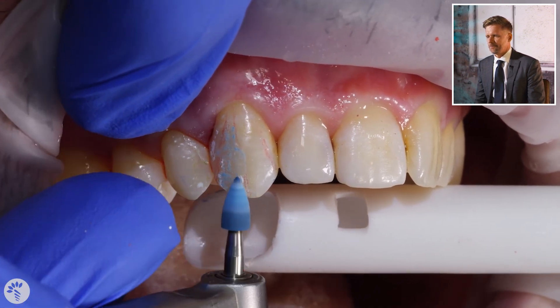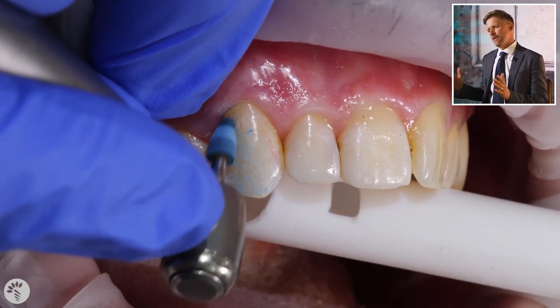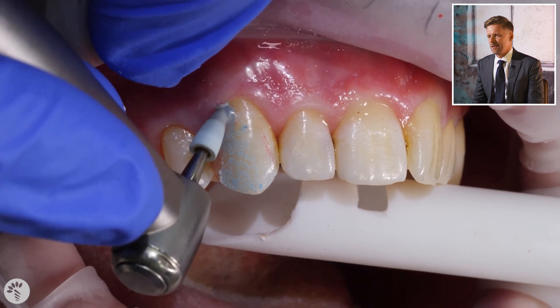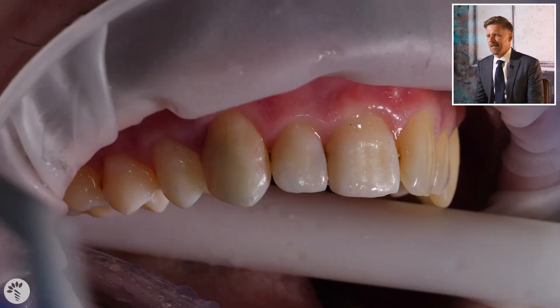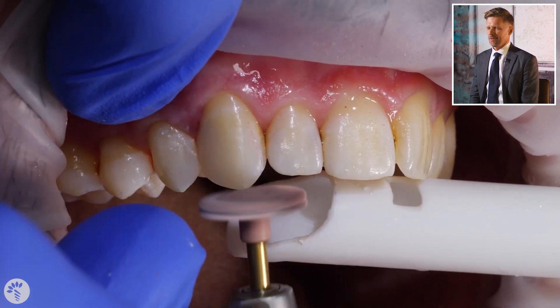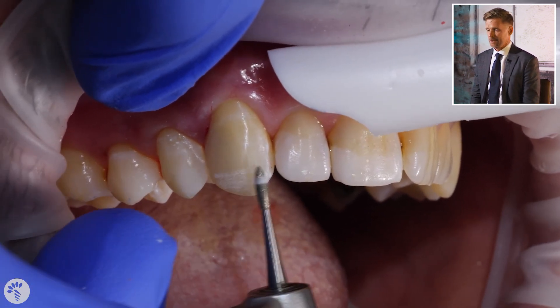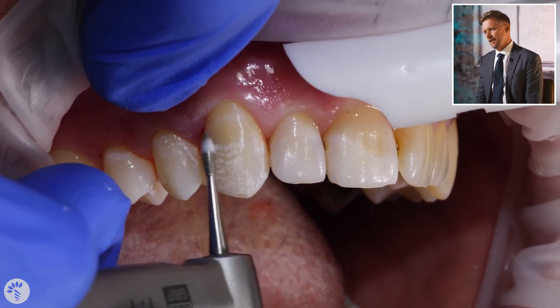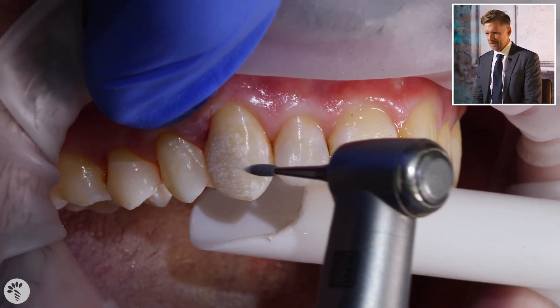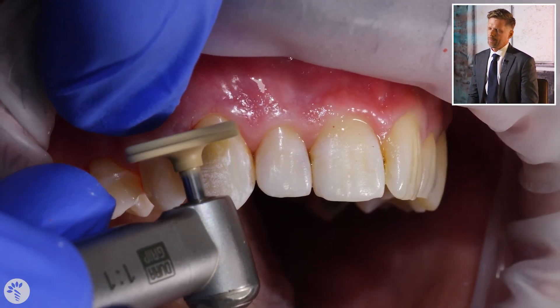If we want more pronounced texture, we'll do that later with a slow-speed bur. We want chunky, square corners at this stage because as we polish, the restoration gets rounder. With ceramics it's completely different — because they're so hard you need to have them rounded before glazing. Now I'm just doing a light polish to be able to see the surface better, and then putting a bit more texture in using a slow-speed diamond bur, using both the side and the tip, running it back and forth to get very faint, natural-looking texture.